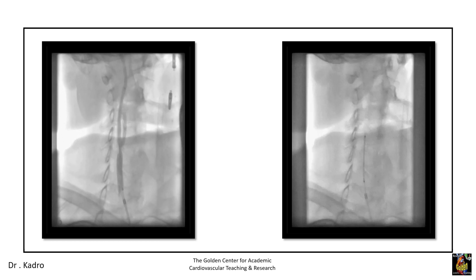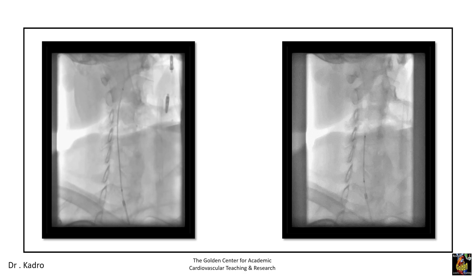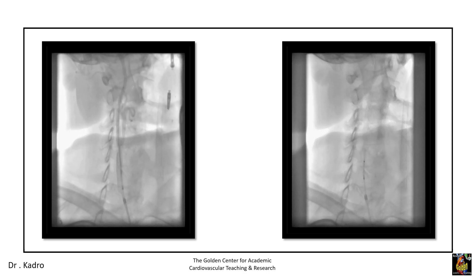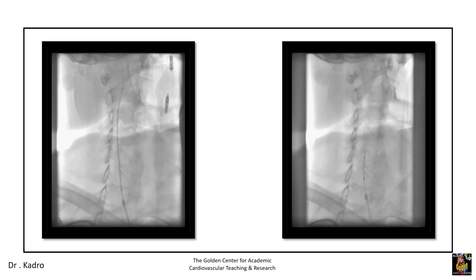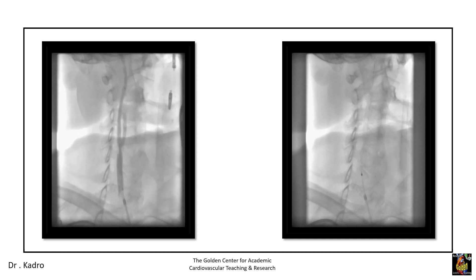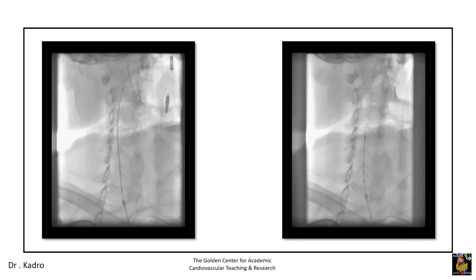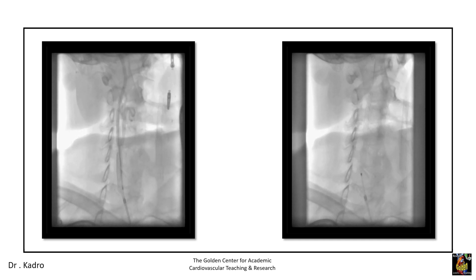This is the self-expandable stent in place, and this is the deployment of the self-expandable stent. This is a nitinol stent with a diameter of 8 millimeters and a length of 40 millimeters.